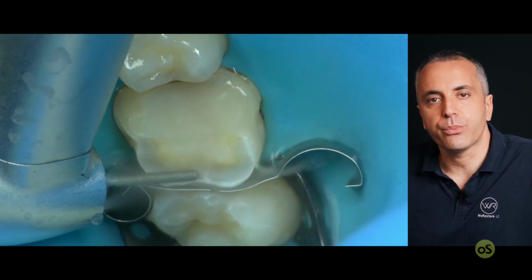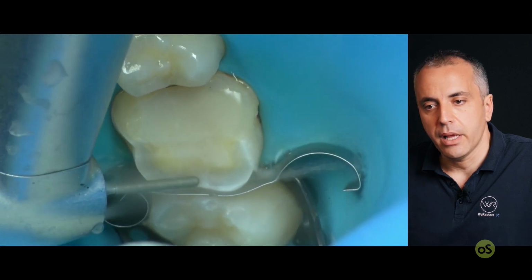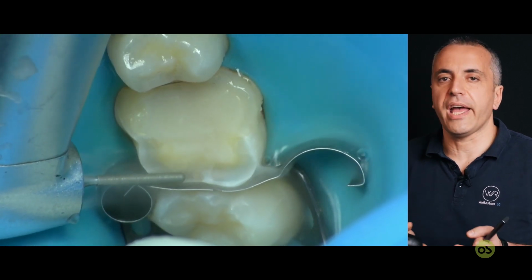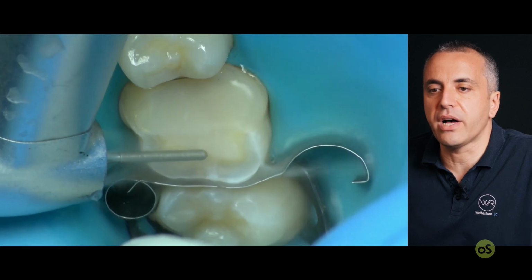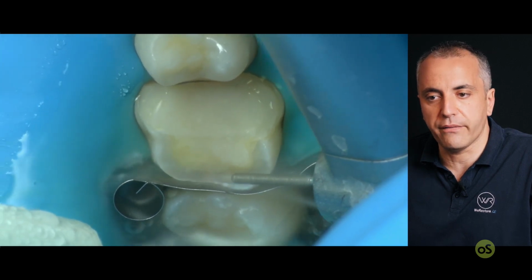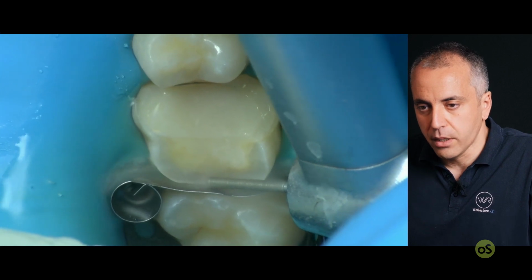Now it's time to prepare interproximally, so we use a very small diameter. And why do we want to prepare interproximally, even if, for example, in this case it is sound? Because of course we have to give the correct emergence profile from the margin preparation, and we need some space to allow the technician to provide a very nice emergence profile of the indirect.